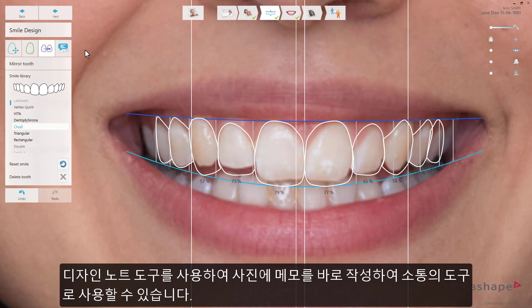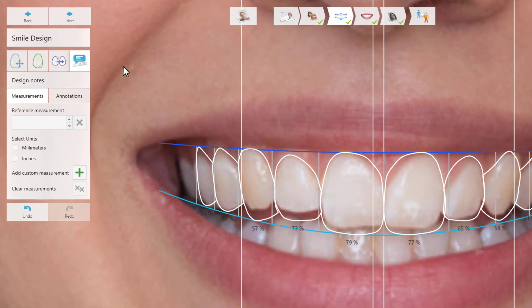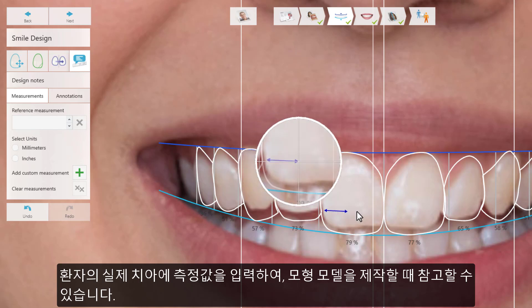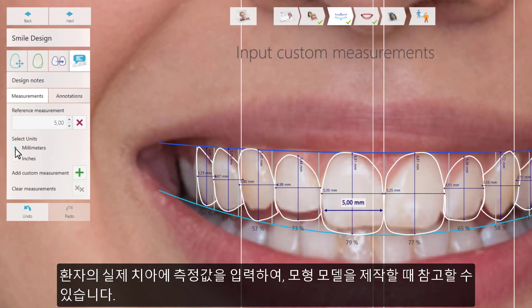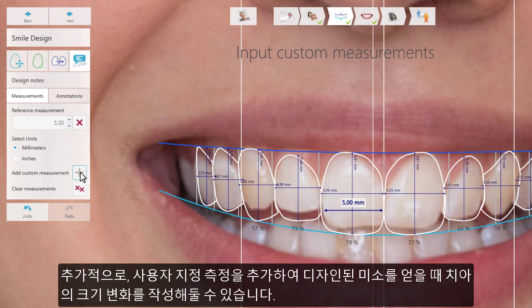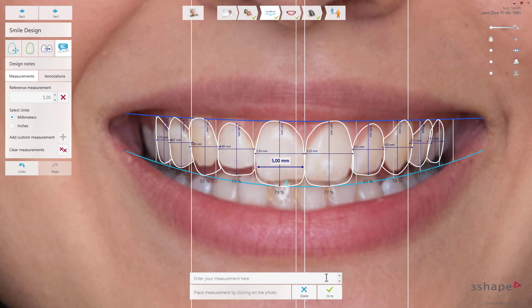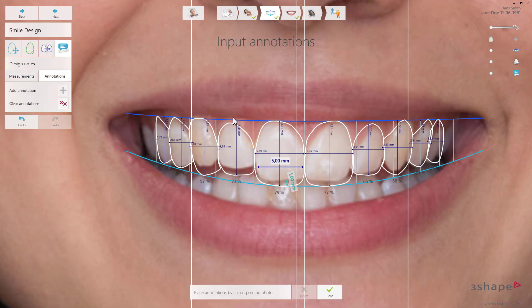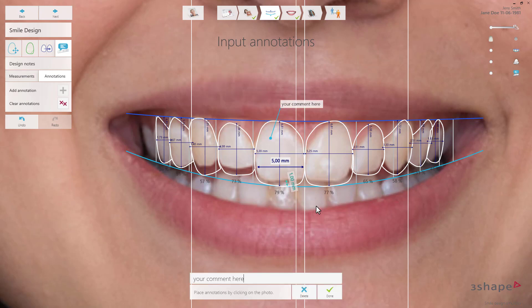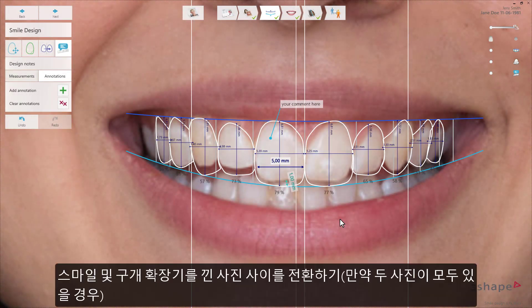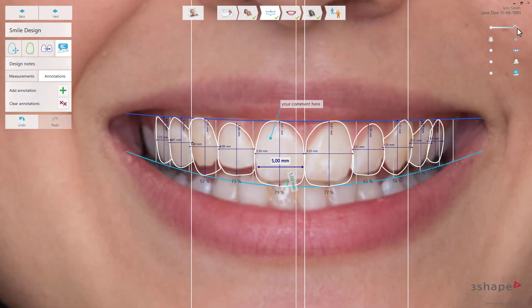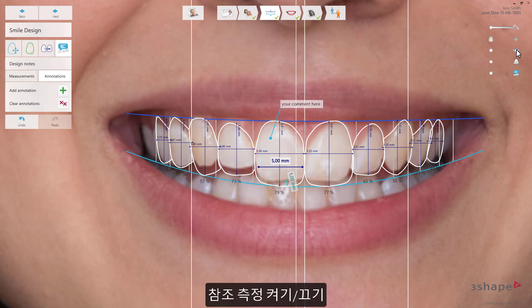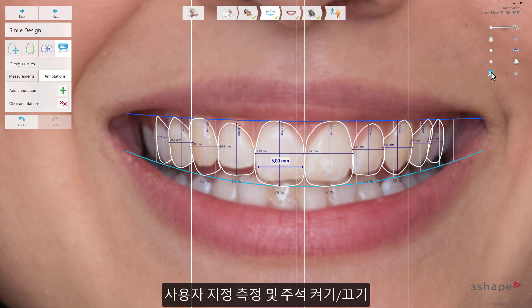The design notes tool enables you to do some documentation directly on the photo and use that when communicating. You can input a measurement of the patient's existing teeth, which can be used as a reference and as input for making the mock-up model. Additionally, you can add custom measurements to document the dimensional changes involved in achieving the design smile. You can also annotate and add written comments anywhere on the patient's photo. When doing a smile design, there are several useful sliders that allow you to switch between smile and retracted photos if both are available, turn simulated teeth texture on and off, hide the smile frame, turn reference measurements on and off, and turn custom measurements and annotation on and off.